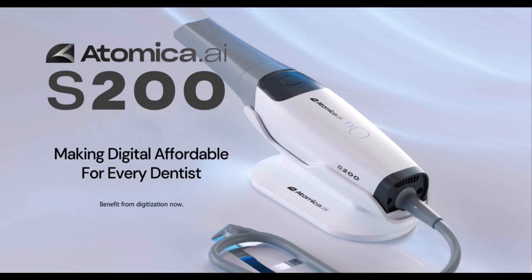Welcome to the future of precision dentistry. In this brief demonstration, witness the precision and efficiency of the Atomica S200 intraoral scanner.